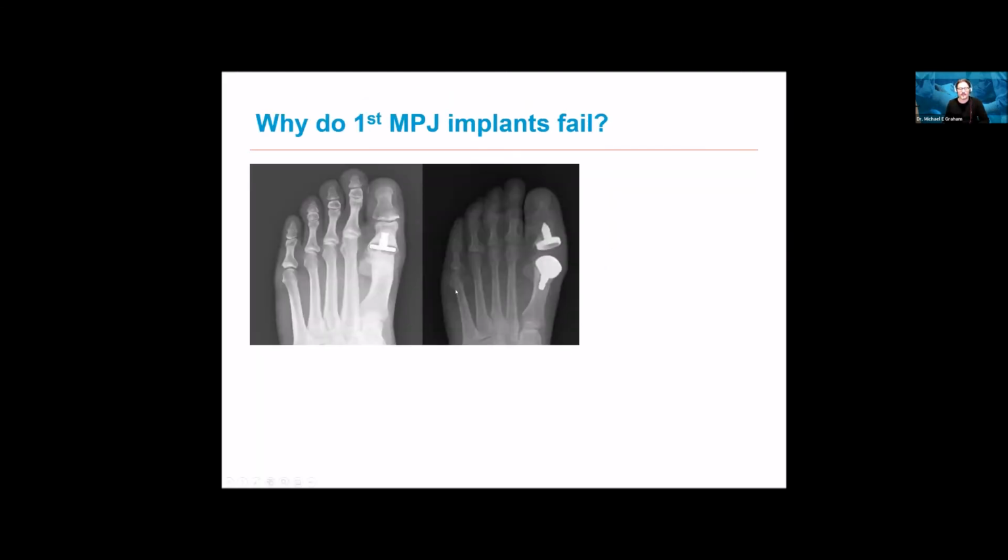So then the patient ends up not going to you, they go to somebody else, and they eventually have a hemi-joint or a total joint replacement procedure performed. And then they end up with complications with the hemi implant or the total implants over here. Now, when the surgeon put these implants in the operating room at the initial surgery, the patient had an excellent range of motion. The position of the implants was absolutely perfect. So why did these implants become complicated like this?